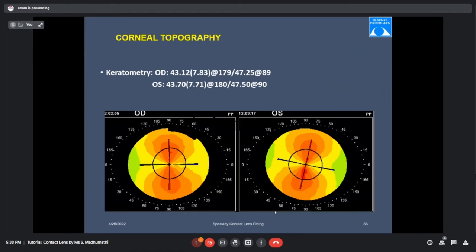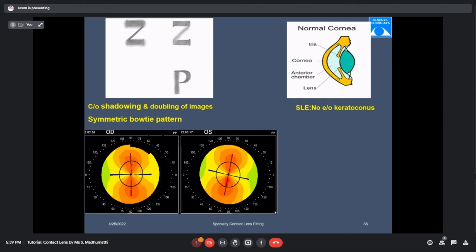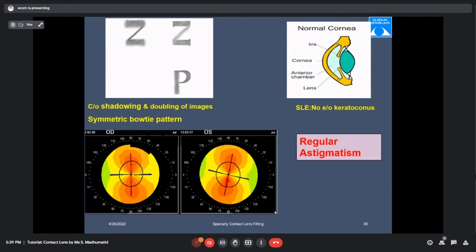Looking at the topography: can you comment on the pattern? A symmetric bow-tie pattern is seen. The red color indicates the steeper meridian, which is vertical. No evidence of KC. This is actually regular astigmatism with the steeper meridian vertical — i.e., with-the-rule astigmatism.